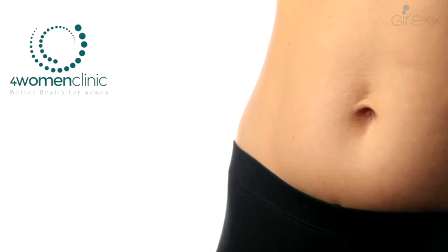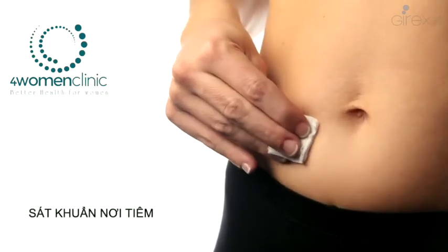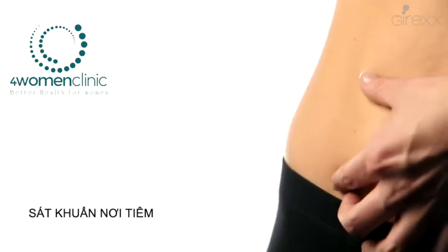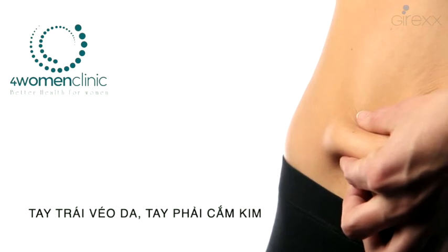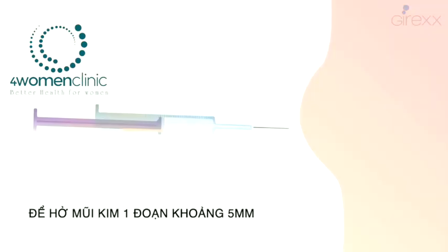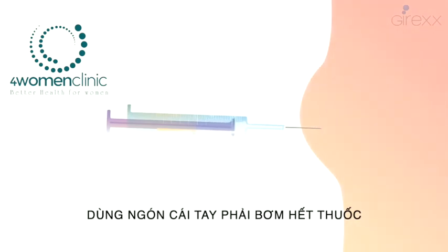Self-administration: disinfect the chosen part of the abdomen with gauze impregnated with alcohol. With one hand, pinch that part of the abdomen. With the other hand, stick in the syringe needle and press gently on the plunger to introduce all the content from the syringe.